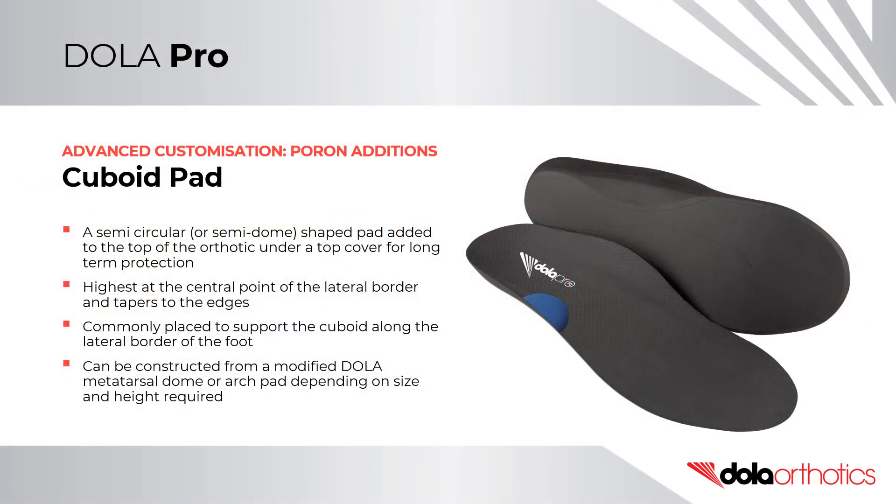A cuboid pad is a semi-circular or semi-dome shaped pad added to the top surface of the orthotic under a top cover for long-term protection. It is highest at the central point of the lateral border and tapers to the edges. It is commonly placed to support the cuboid along the lateral border of the foot.